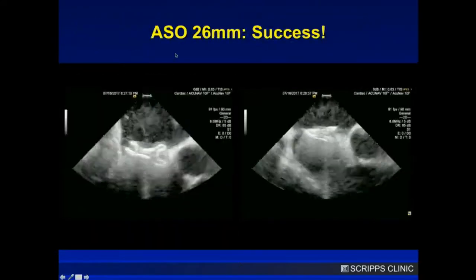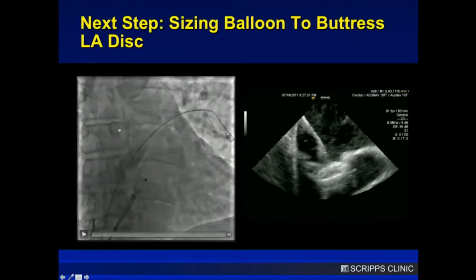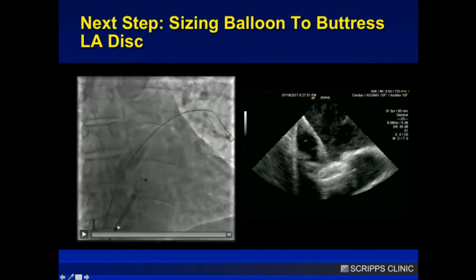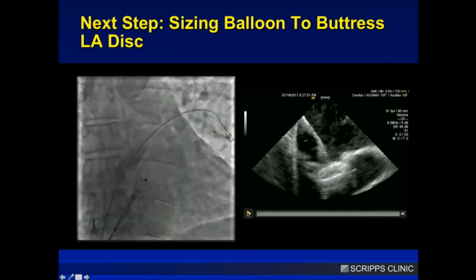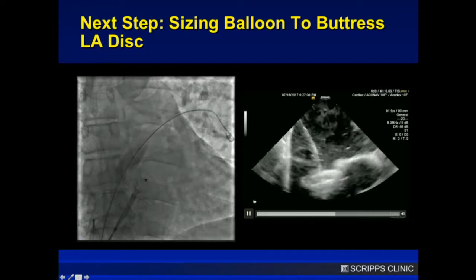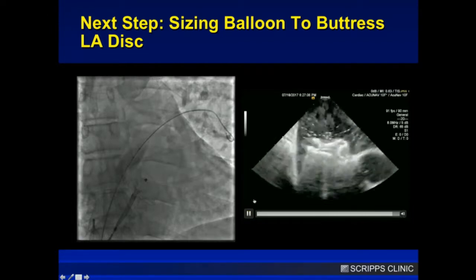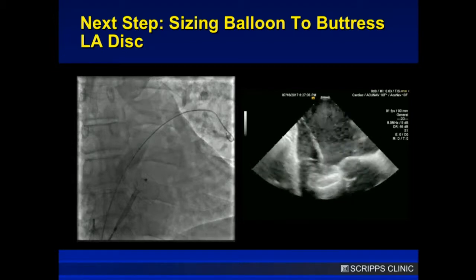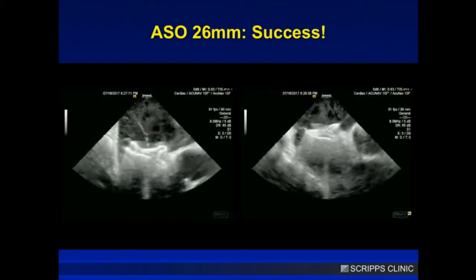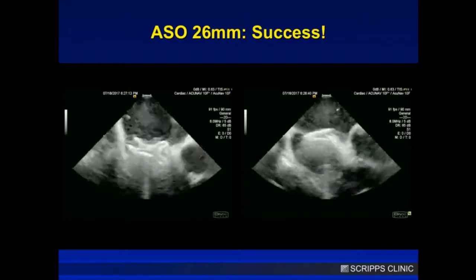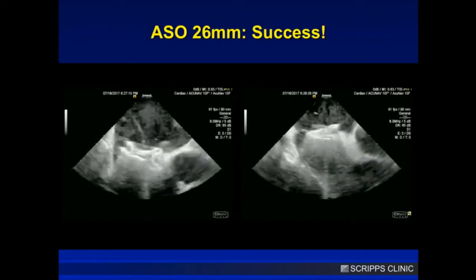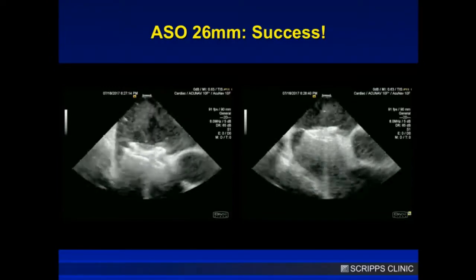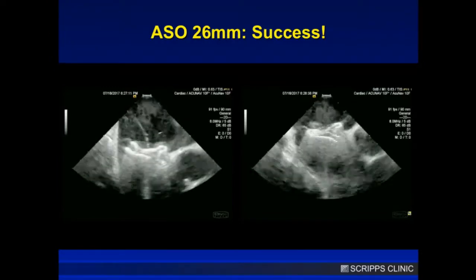Here's the actual deployment. You can see how the balloon kept the left disc from falling. On Echo you can see how it's now really close to the aorta — we caught the aorta. You're essentially pushing the disc onto the aorta, shifting the discs of the device. And the result looks terrific.